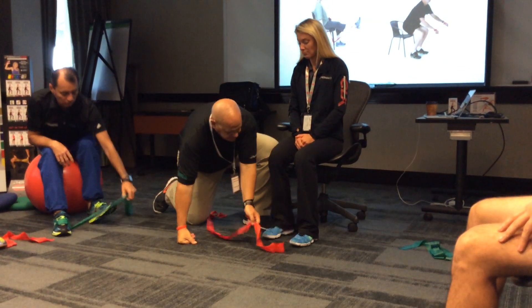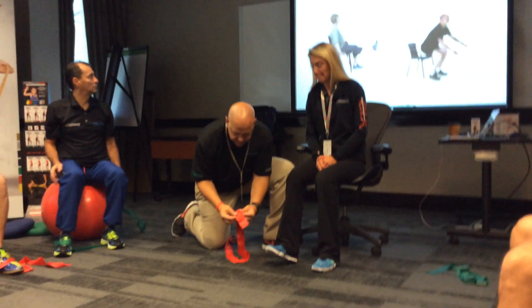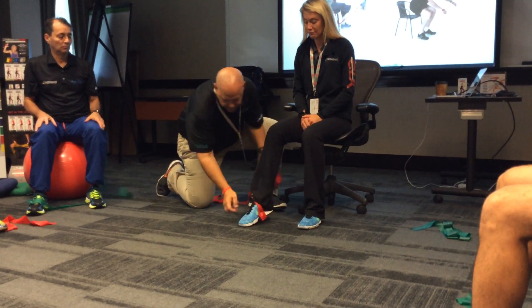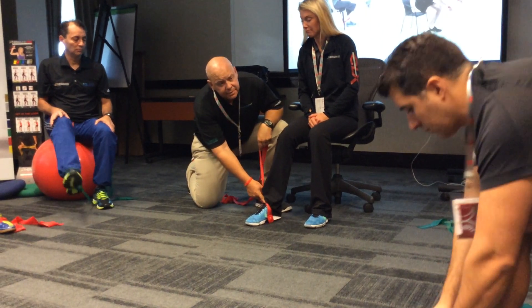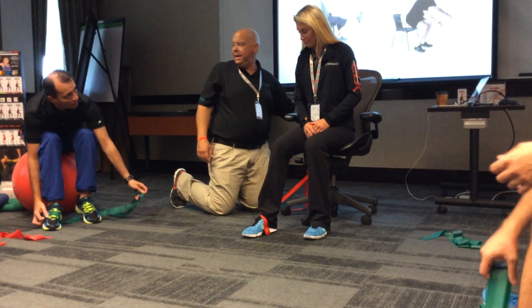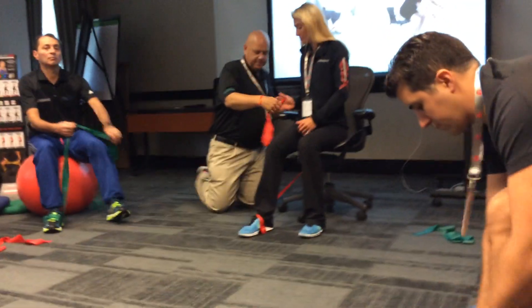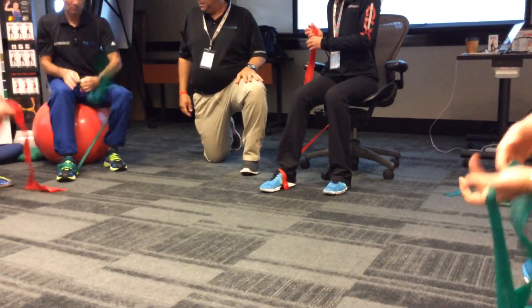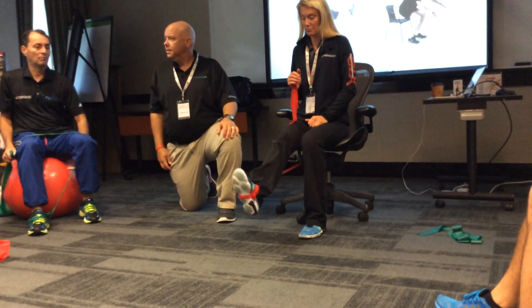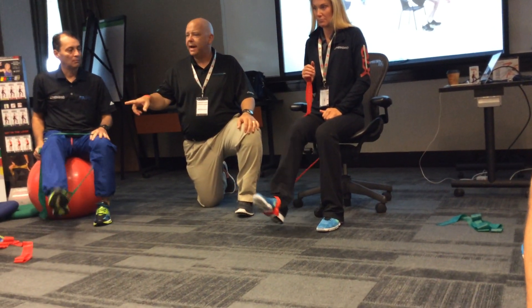By taking this out, let's just wrap the band up here. She can take this band and bring it up behind and hold it. Now she can do leg extension here. There's no more tying of knots.